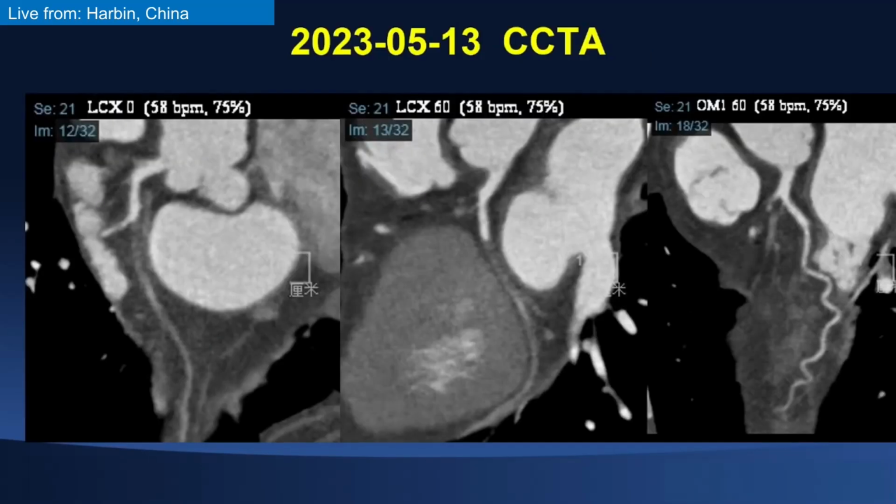And then we performed a CTA scan on the patient, and the results showed that the occlusion length is very long, more than 20 millimeters, with no calcification. In order to understand the coronary artery lesion deeply, the intelligent visualization system for CTA invented by Professor Li Yue in our hospital would help us to get more information. Please, Professor Li Tiankai, introduce this part.